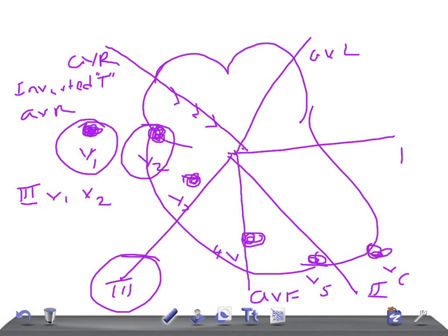The T wave should not exceed half the size of the preceding QRS complex. This is really very important. If you want to evaluate the T wave, always look at the QRS complex as well. Recognizing tall T waves is not easy, but if you look at EKGs often, it becomes easy to identify the abnormality.